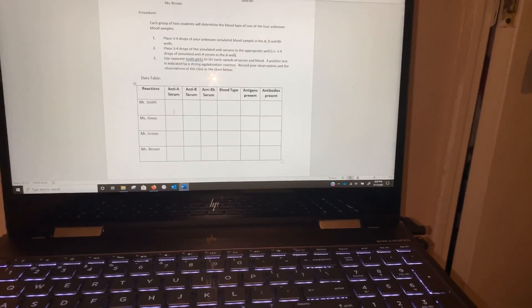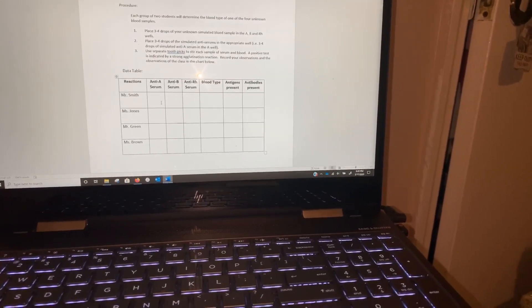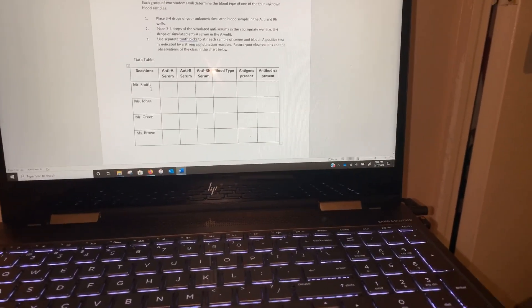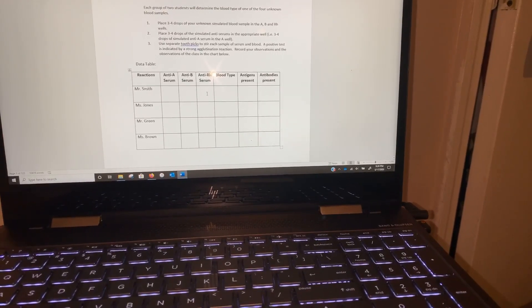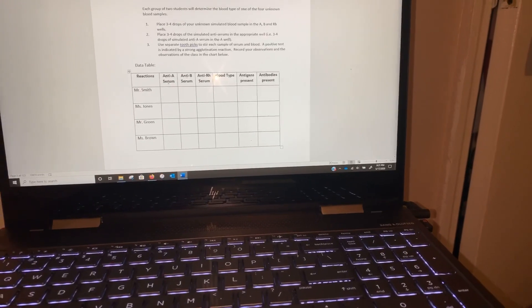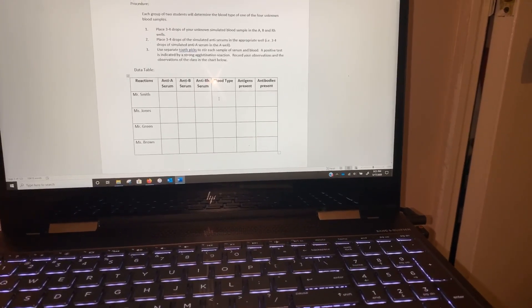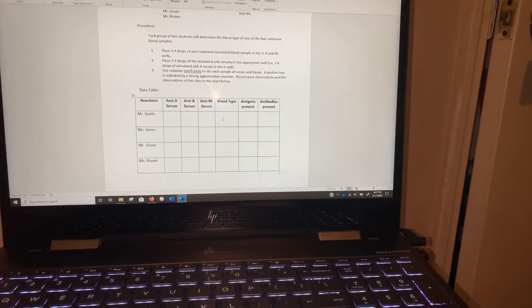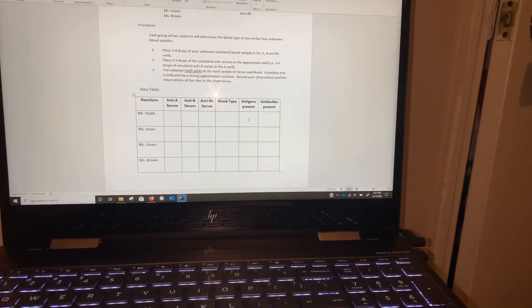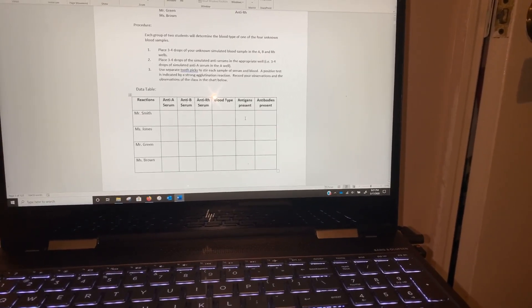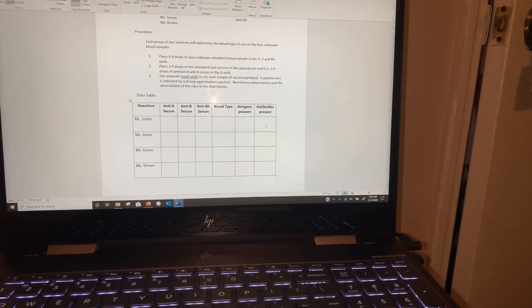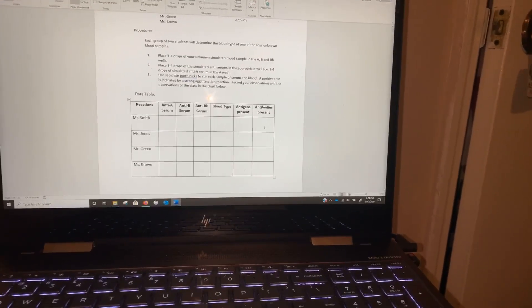I'm going to tell you for Mr. Smith, but for Jones, Green, and Brown I'm not going to give you the answers. Mr. Smith: there is clumping in the A well and the RH well. Clumping means they have those antigens because I put the antibodies in. So if he has A antigens and RH antigens, that would be blood type A positive. This person has A positive blood.